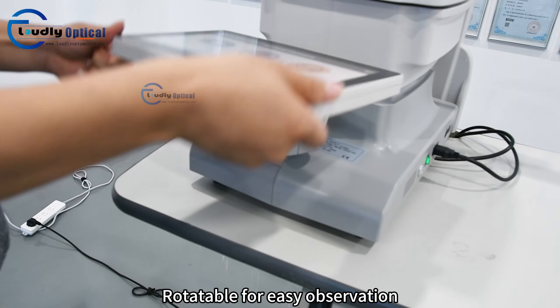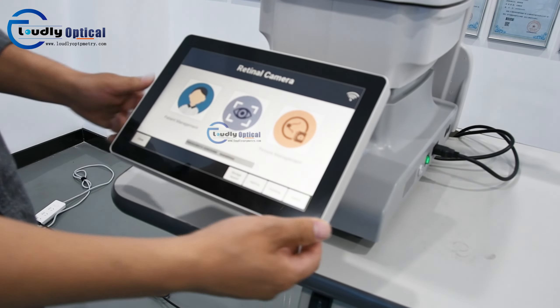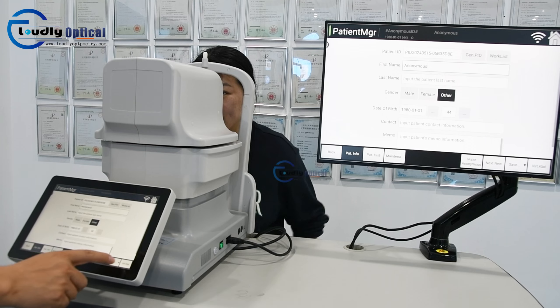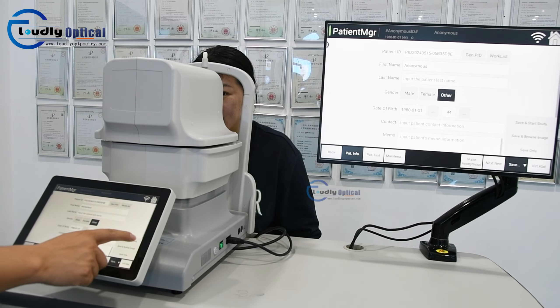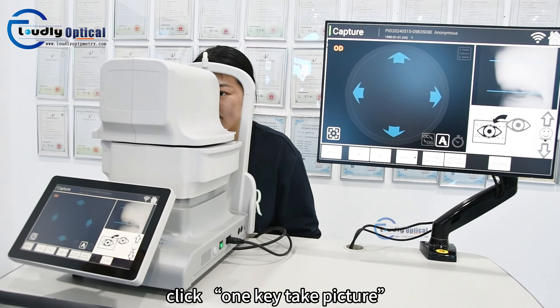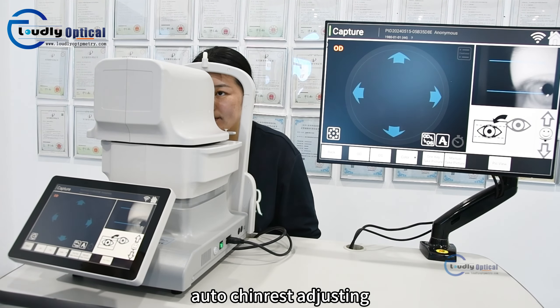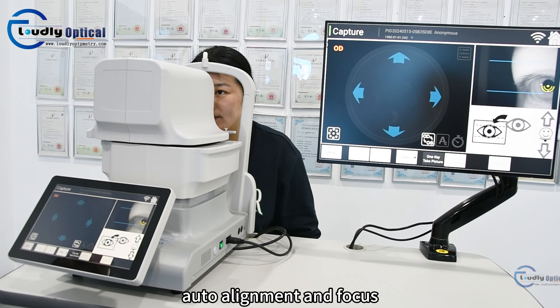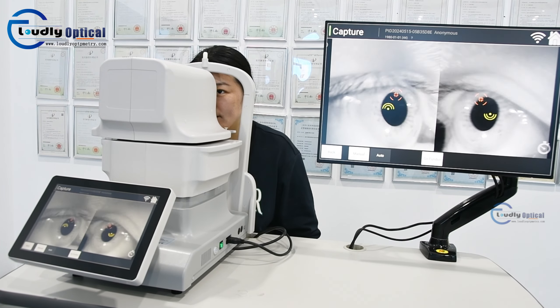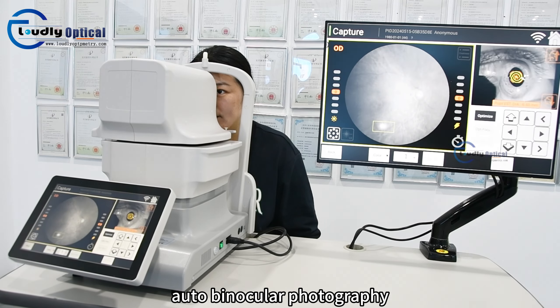Rotatable angle for easy observation. Patient information input. Click one key to take picture. Auto chin rest adjusting, auto alignment and focus, auto binocular photography.